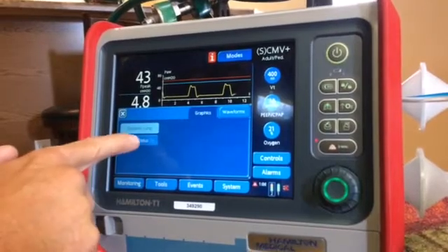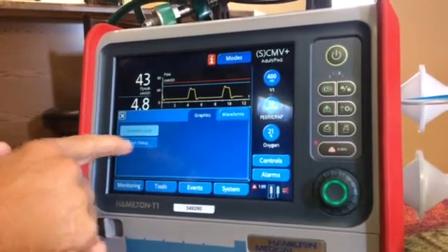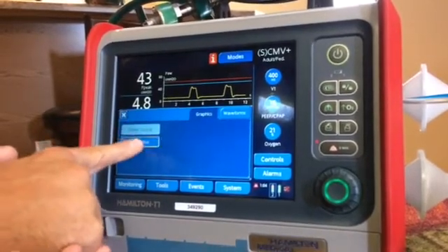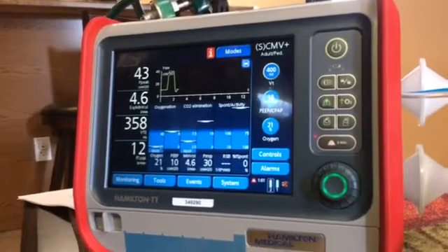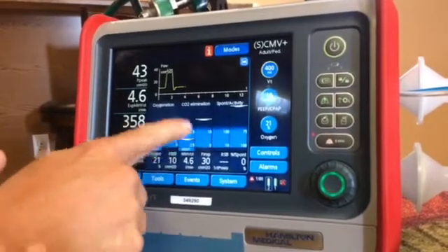This is a pretty common screen that people like to use. You can also do the Vent Status screen, which is more for respiratory therapy than for general use.